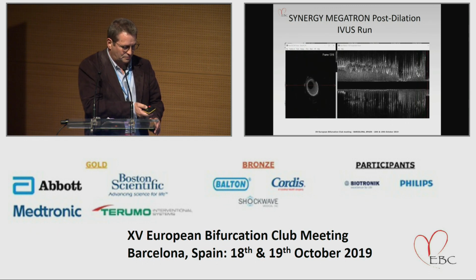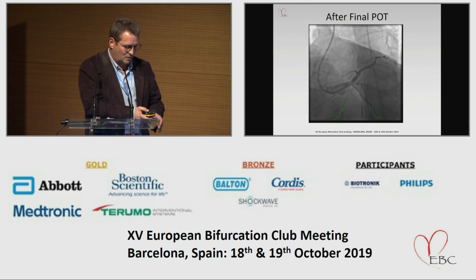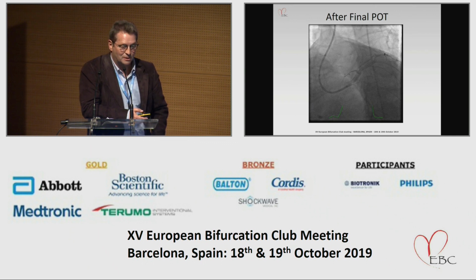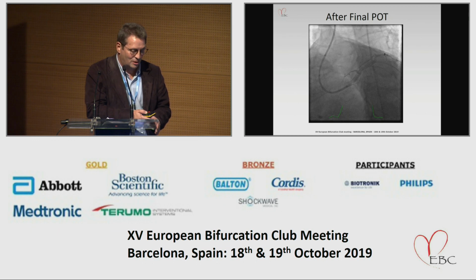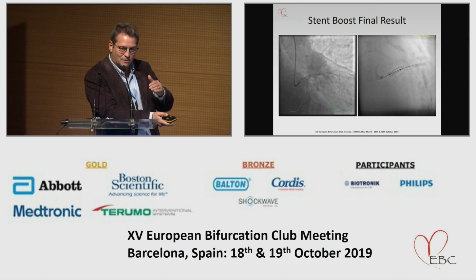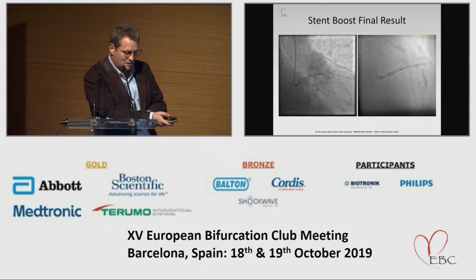So, coming to conclusion, this was after the final POT, and it's quite easy to see that there's a large left main part, and even not so small distal part as well. So this is the StentBoost. In one angle, it's not the angle where you can see to the POT side, just to realize that the geometry in the stent was nice.